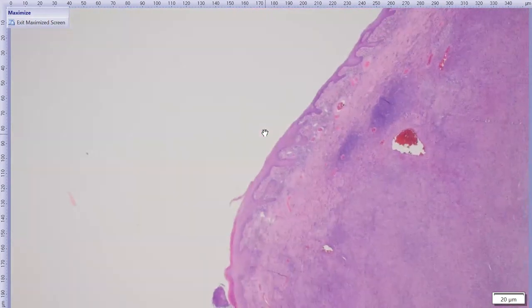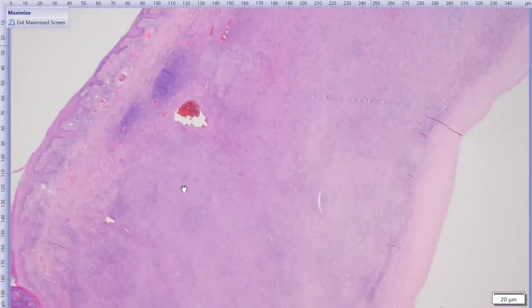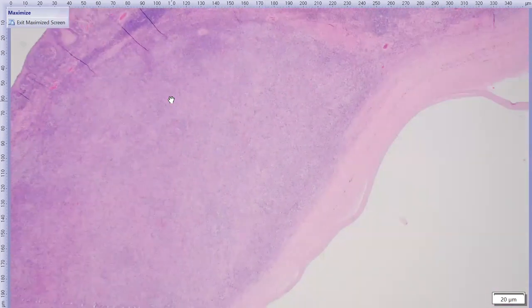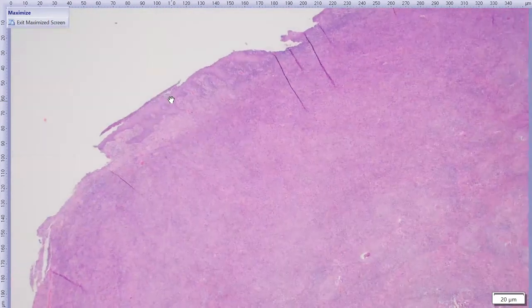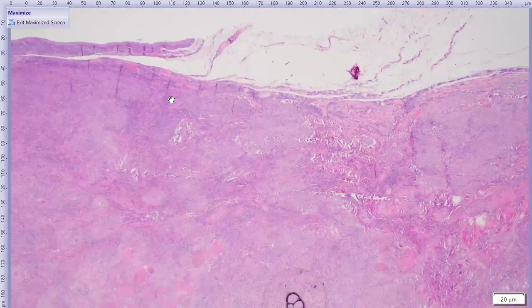Some people call this epidermalization of the corneal surface because this resembles the epidermis much more than it resembles the corneal epithelium. But anyway, the corneal stroma itself is expanded by a dense population of cells. It's also vascularized. There's a nice blood vessel. And you can see that this population of cells is a little bit heterogeneous. It's a little bit more pale here, and then we've got some foci where it's darker purple. That generally means that there is a mixed cell population. Now at this magnification, we can't really tell if this is neoplastic or reactive or inflammatory. So we're just going to go to higher magnification here.